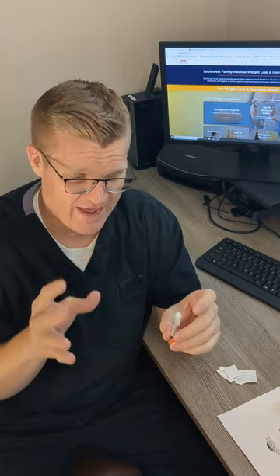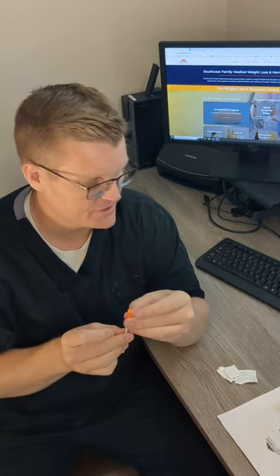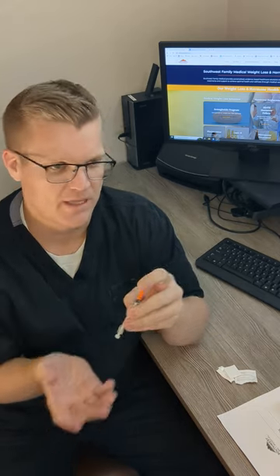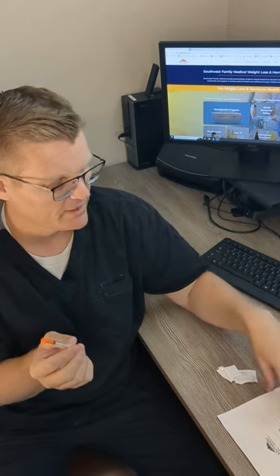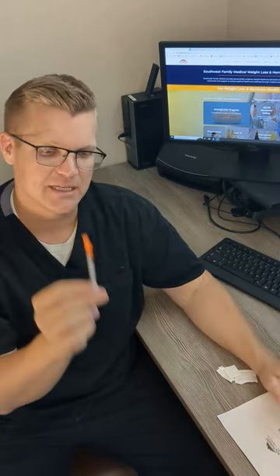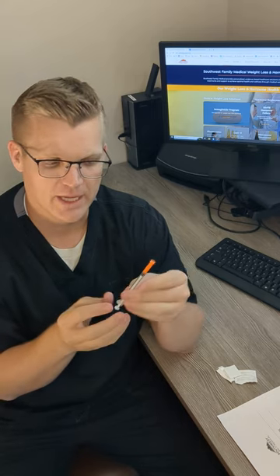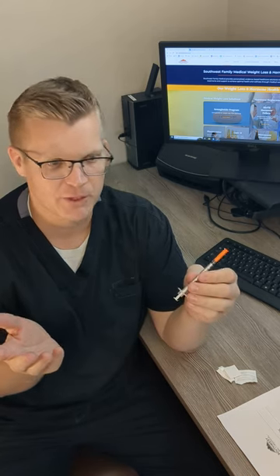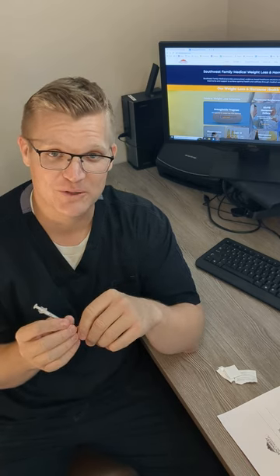Semaglutide goes in so fast. Don't be scared about injections. If you're still nervous, still concerned, or not sure on the dosing — how far to pull it back — call your weight loss coordinator. They'll talk to you about how much to draw. Please read the directions carefully; your product will have a prescription label telling you exactly how much to inject. A lot of people who have never done this before find it a little intimidating, but once you've done it once or twice you'll become a pro — it's very simple, painless, and very effective. Scott Taylor here, Southwest Family Medical — have a great day.